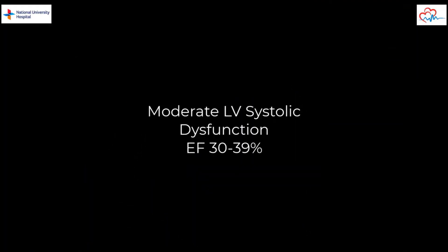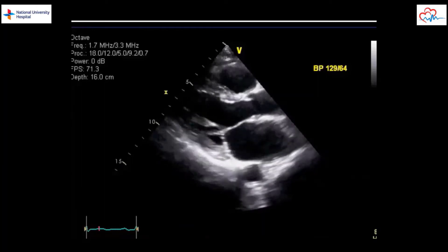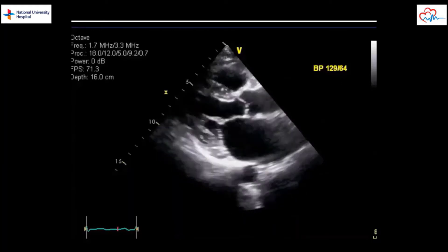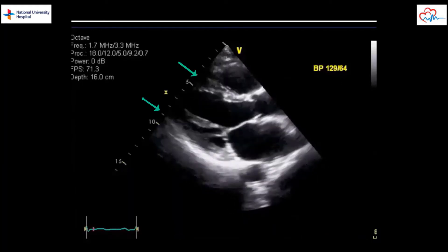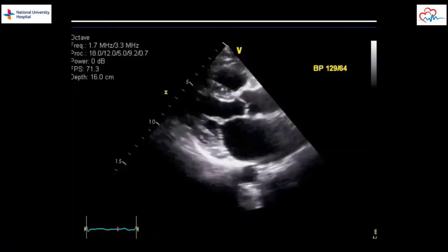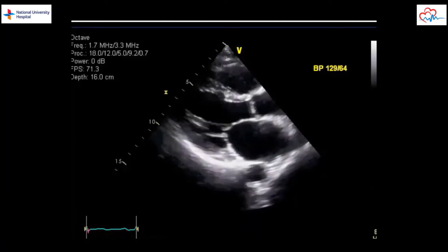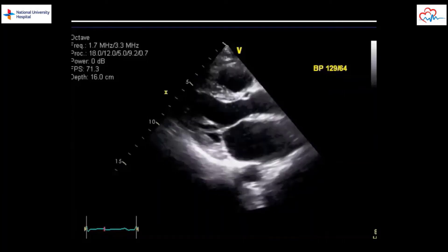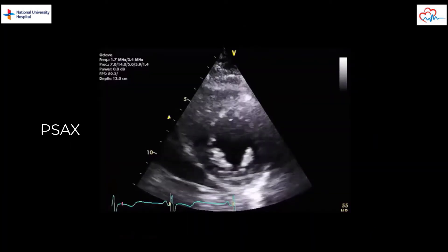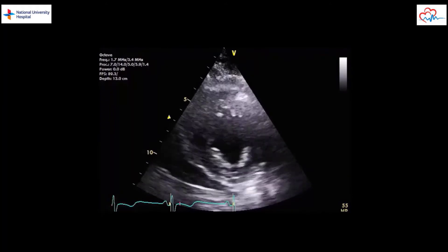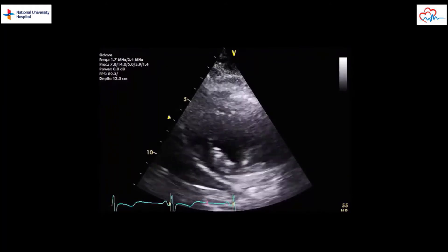Next we can look at an example of a patient with moderate LV systolic dysfunction. In the parasternal long axis view, thickening and movement of the LV walls during systole is less compared to the previous case. This is an example of moderate LV systolic dysfunction. When making an assessment, we need to look at multiple views as well. Here we see the same patient's left ventricle in the short axis. Once again it is evident that wall movement and wall thickening is reduced. Ejection fraction can be estimated at between 30 to 40%.